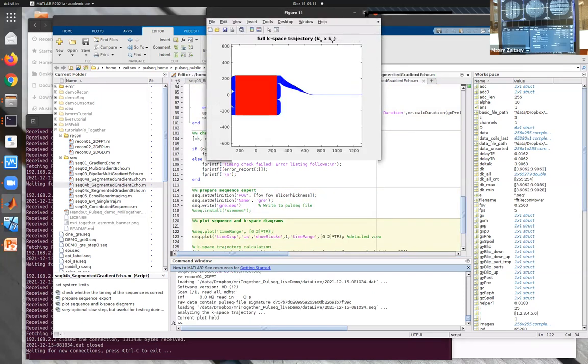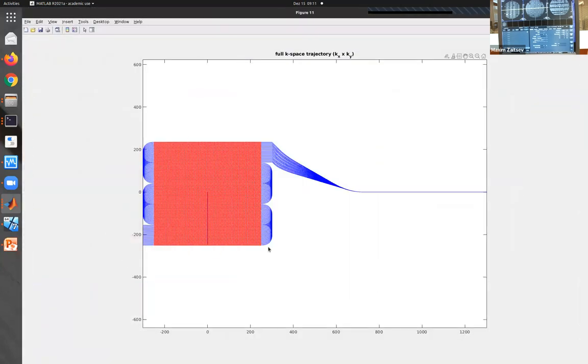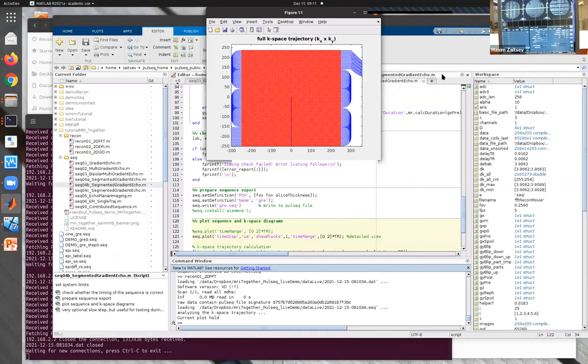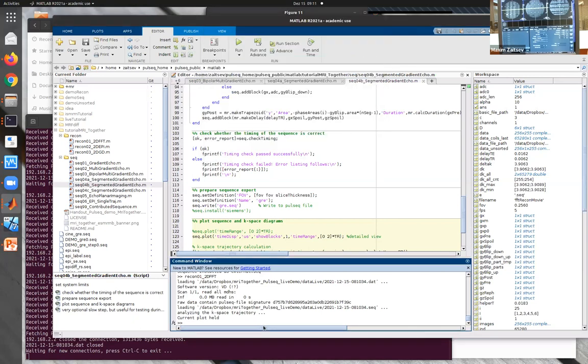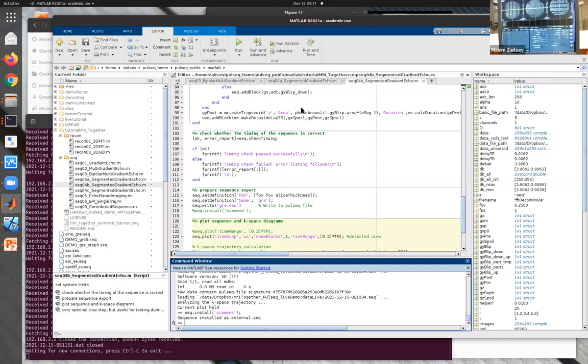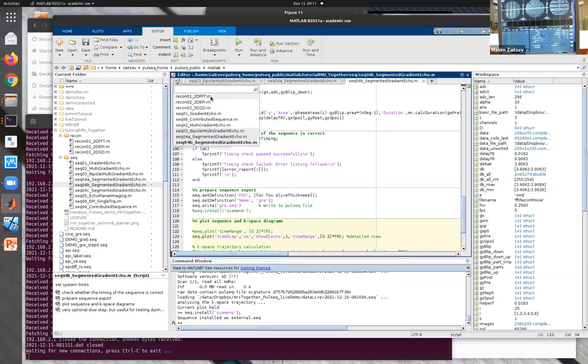So you can see in k-space, we use higher gradients. That's why we need more time to actually turn around, and you now can appreciate this turning in k-space, which we need to do. We also have 5 segments, so you can see what's going on, and we turn around. You can also run that one. You see, because of the segmented k-space, the number of phase encoding steps is really going down dramatically, so the sequence gets very fast.